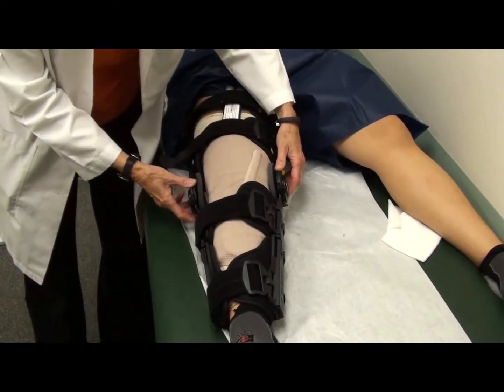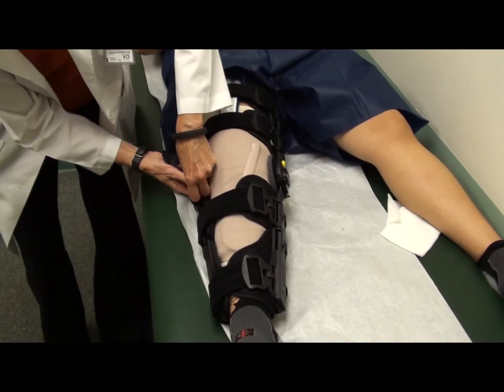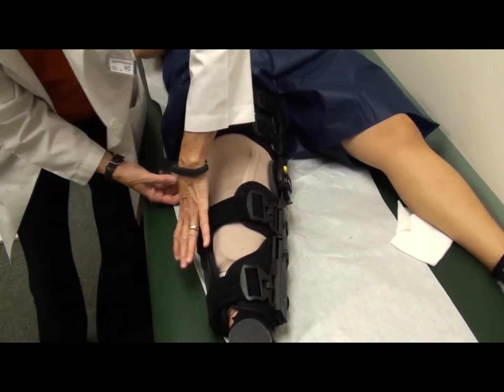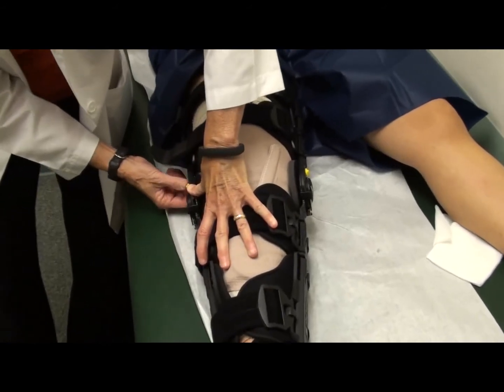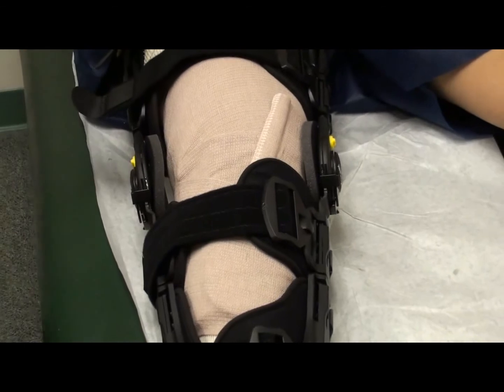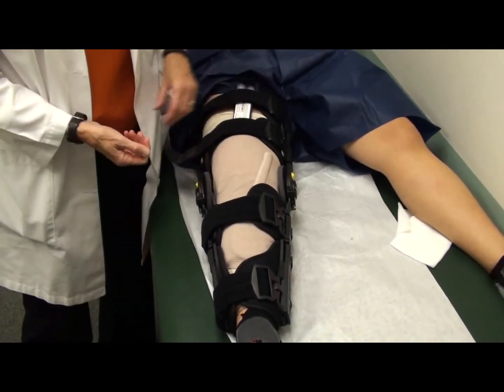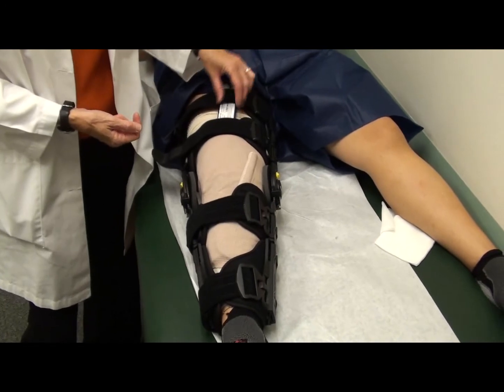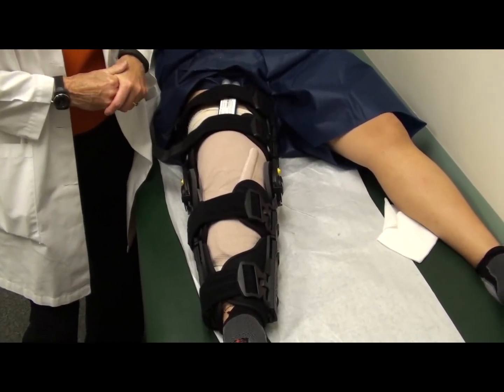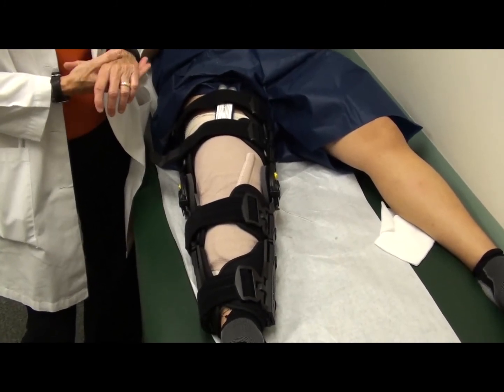Now make sure if you've unloosened the hinge that you clip the yellow piece and lock it. The best way to do that is push down on the hinge first and then click it to lock it. I would again recommend you can get in and out of this brace several times a day to get into your CPM, and you can also take the cold pad off whenever you don't need to use it. So hopefully that helps you through your journey of getting your brace and your dressing changed.